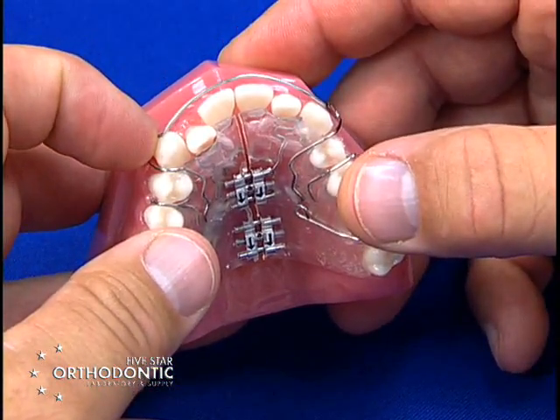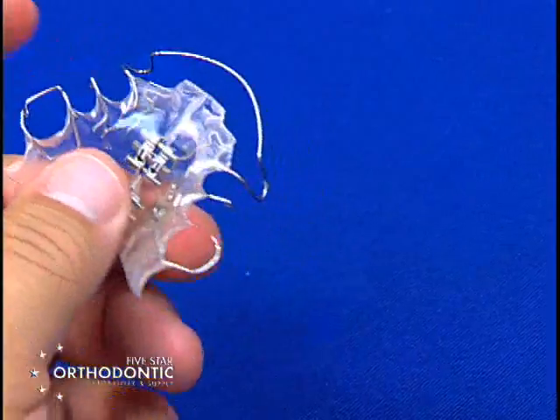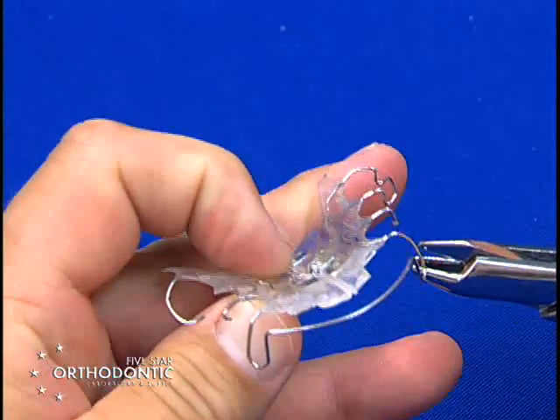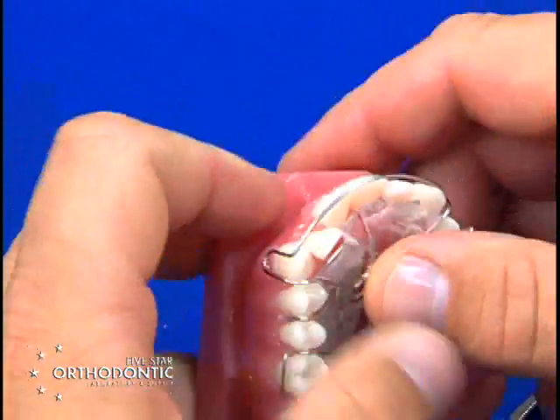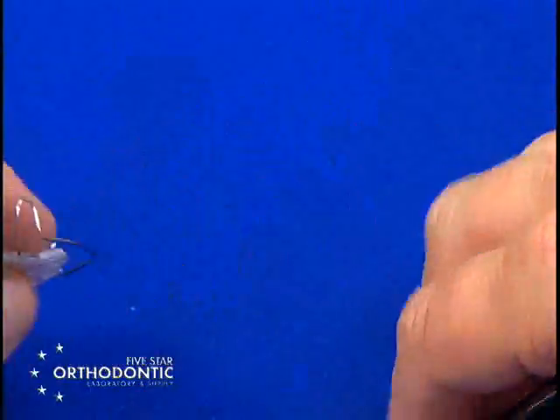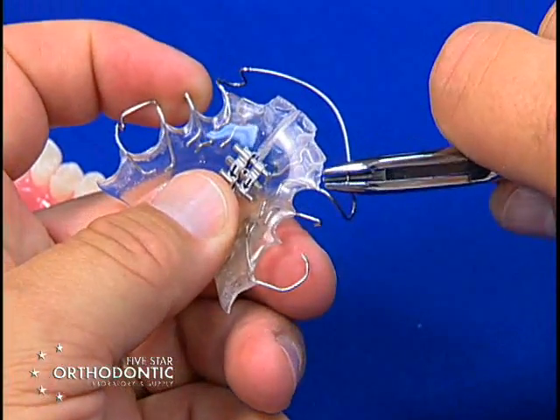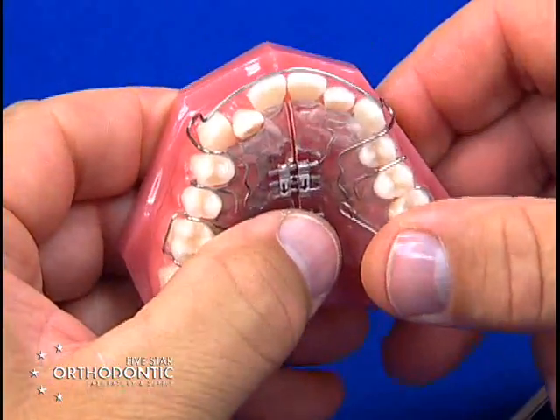If you've taken the bow too far out of contact, to bring the bow back into contact you take the three-jaw plier, place in the omega with one jaw inside and two jaws on top, and squeeze to retract. Go to the other side and squeeze to retract. As you squeeze and retract, the bow will go more incisal, so to level the bow you take the three-jaw plier with one jaw inside the corner and two jaws straddling the corner, squeeze to level the bow and bring it more gingivally. Do this bilaterally to level your labial bow and bring it back into contact.